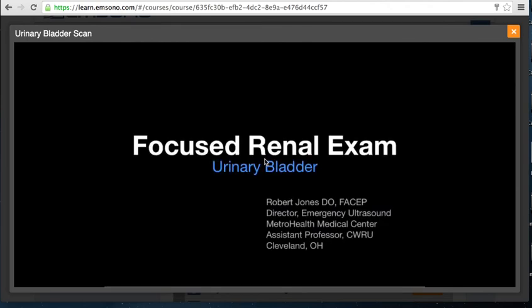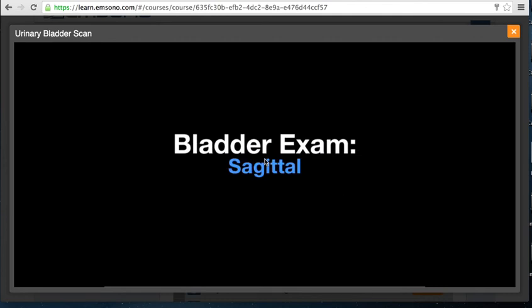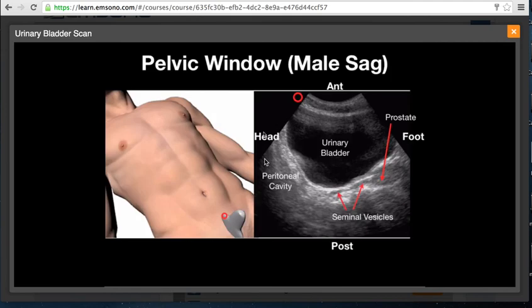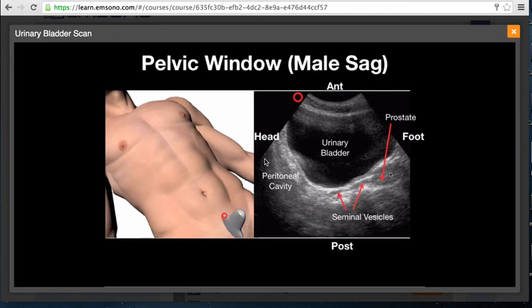I'm Dr. Robert Jones, and in this lecture we will cover how to perform the urinary bladder evaluation, beginning with the sagittal exam. For a male patient, place the transducer with the indicator directed toward the patient's head, just cephalad to the pubic symphysis. This provides a view with anterior, posterior, head, and foot orientation. You will have the urinary bladder anteriorly with reverberations in the near field, the peritoneal cavity cephalad to the bladder, and the seminal vesicles and prostate posteriorly.